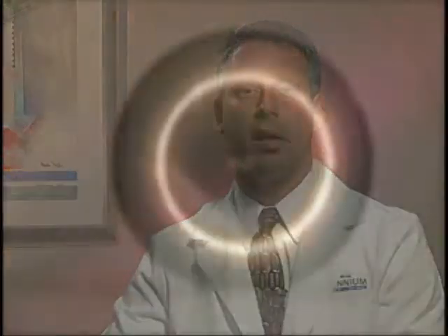This flap is then lifted to deliver the laser treatment. It will cause your vision to become very blurry. Your job will be to focus on the blinking light even though it will appear blurry. The laser itself makes a rapid tapping noise and most patients will notice an odor similar to a singed hair. This is normal. Typical laser times range from 10 seconds to over 2 minutes depending upon the level of your prescription and the type of procedure that is being performed.